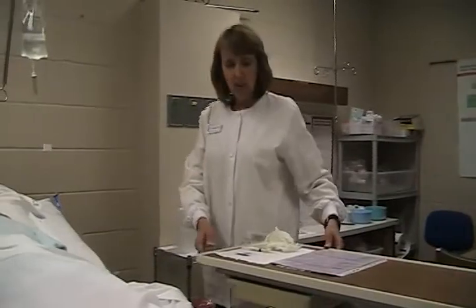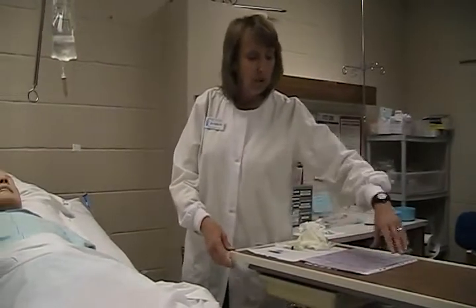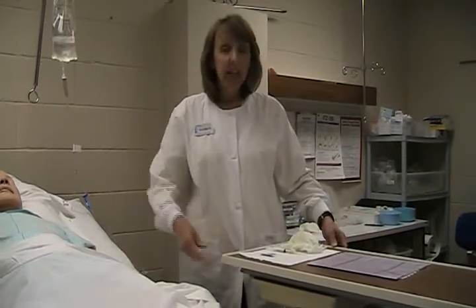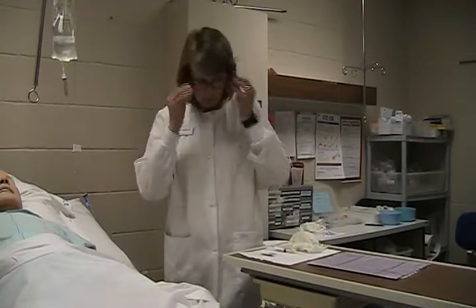Re-identify your patient, checking for the patient's name, birth date, and medical record number, and remembering to check if the patient has any allergies. At this time, then, you are ready to administer the medication. Wash your hands and apply clean gloves.